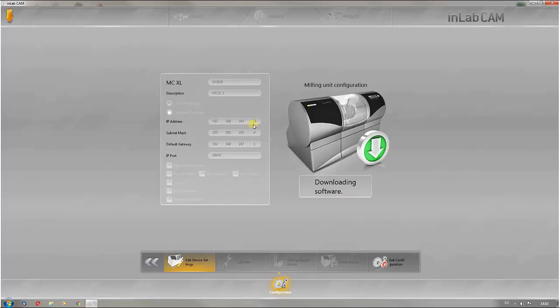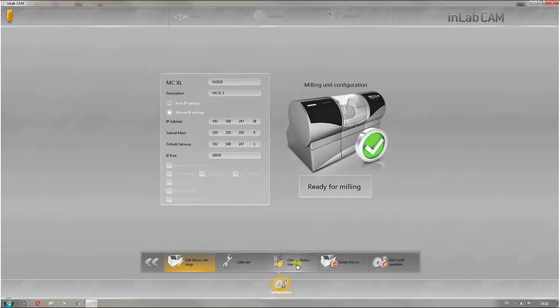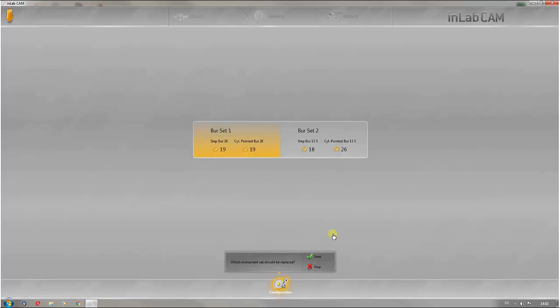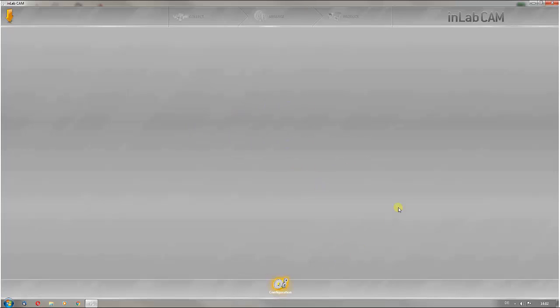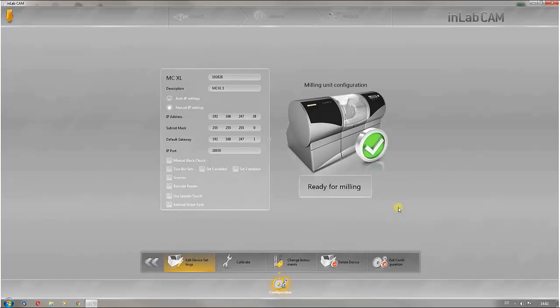You also have the option here of changing the MCXL instruments. Moreover, the machine can be calibrated by clicking on this button.